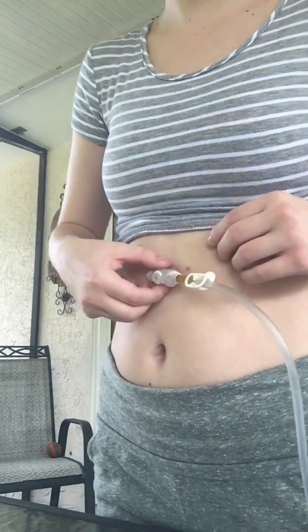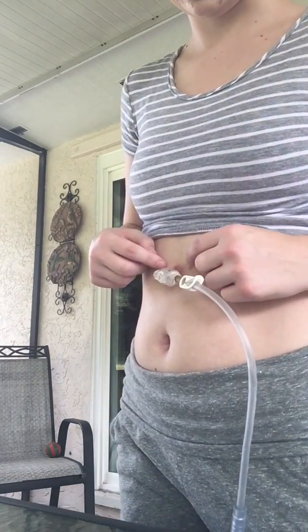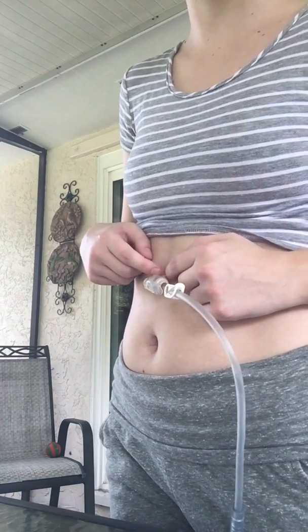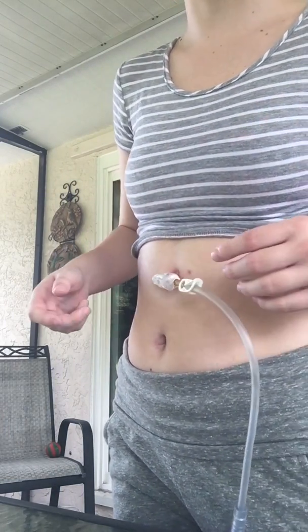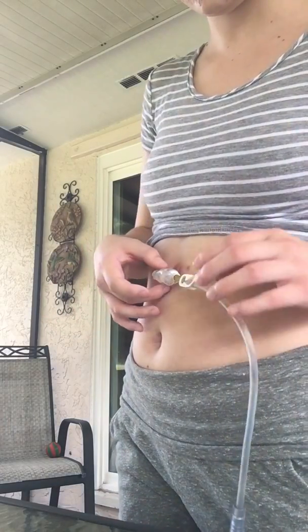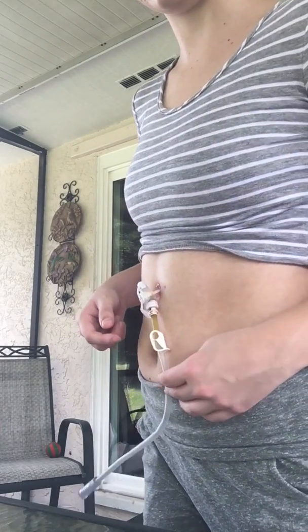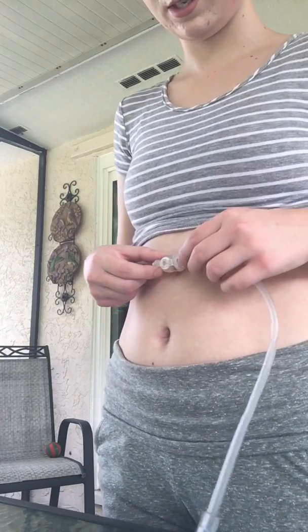And then, as you can see, yes, I can move it in and out, and it does move in and out on its own. And actually, air and acid sometimes comes through the hole and makes a farting sound, which is actually kind of hilarious. But it does dangle some, and it can move around. This is really heavy, so it does kind of make it dangle some and twist.